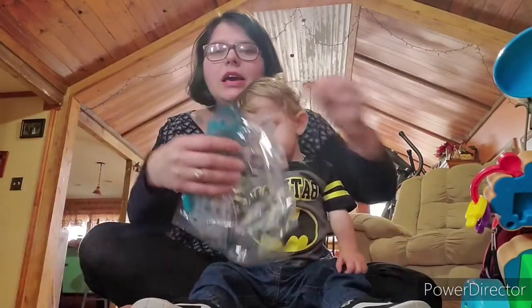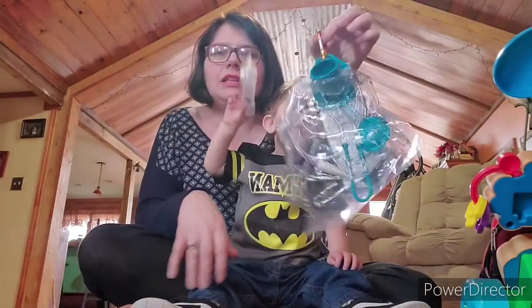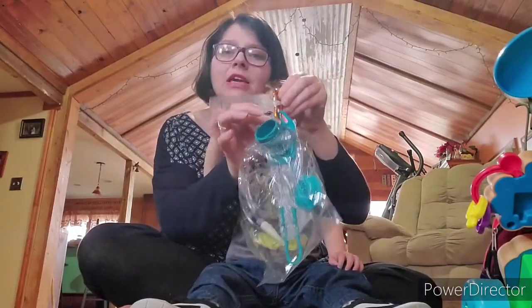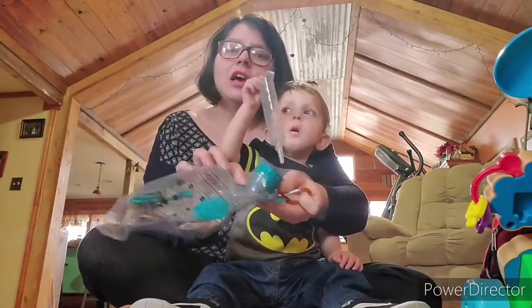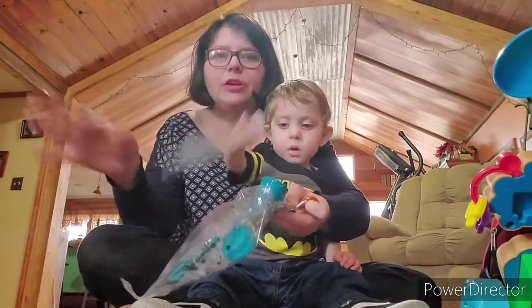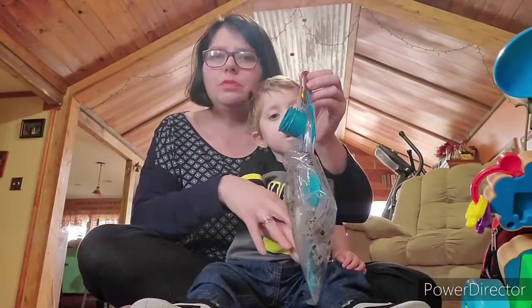And then I put this on right here and it hangs inside the backpack. As long as this part right here is hanging, you should have no issues. Now the problem is if this lays down flat, then you will get a no food error and your pump will start going off and giving you error messages. But as long as this hangs like this, you should be fine.